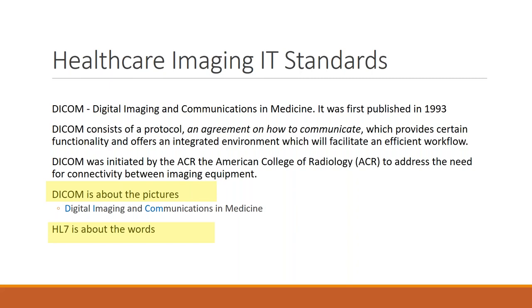DICOM consists of a protocol and agreement on how to communicate. For those of us who have been in PACS long enough, you may remember back in the day where you'd get a disk of images, you'd try and put it into your system and load it up, and you couldn't do it. The images were there, but the DICOM reader was different than the system you had. So they had to come together and talk about how do we come up with these standards. So DICOM is one of those standards, and it was initiated by the ACR, the American College of Radiology, to address the need for connectivity between imaging equipment.